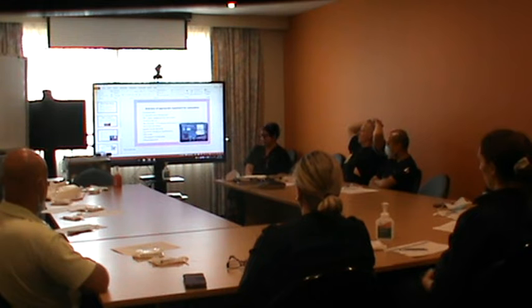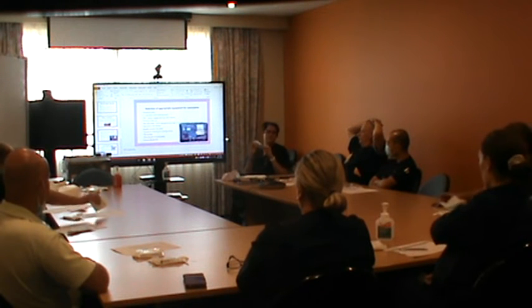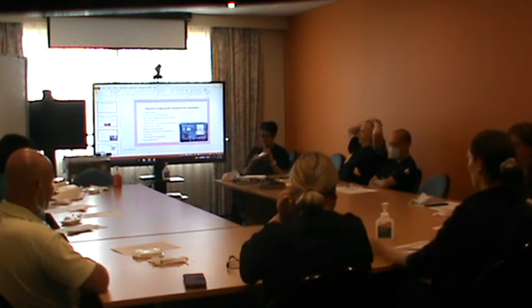Selection of your equipment is very important, making sure that you're getting the right equipment before you go to the patient, of course. So the trolley, whether it be an IV trolley, whether it be a dressing trolley, whatever you use, you've got to make sure you've got that. Now, the cannulation packs these days are your little white seal packs that you've all got in front of you.